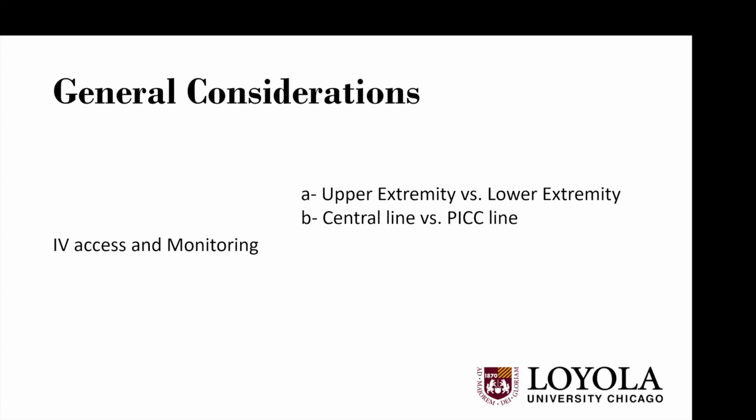Usually what we do is when the baby comes in the cath lab, at the time of induction, put the pulse oximeter and blood pressure cuff on both lower extremities, so that we have upper extremities for placing IV. Once the IV is done and everything is secured, we switch the pulse oximeter and blood pressure to the upper extremities, because they are going to be working on the lower extremities, and your pulse oximeter may not be most accurate when they are messing with that femoral artery. And same is true for the blood pressure cuff.